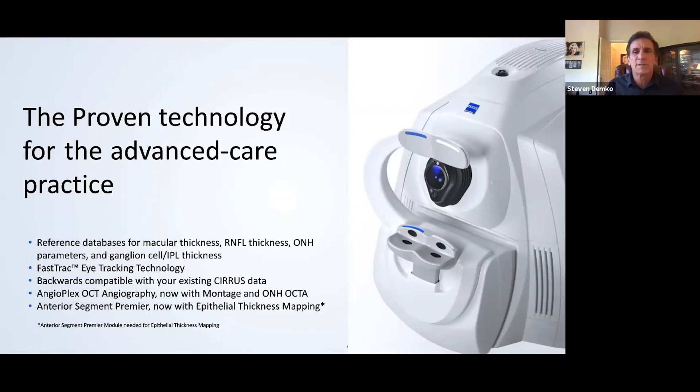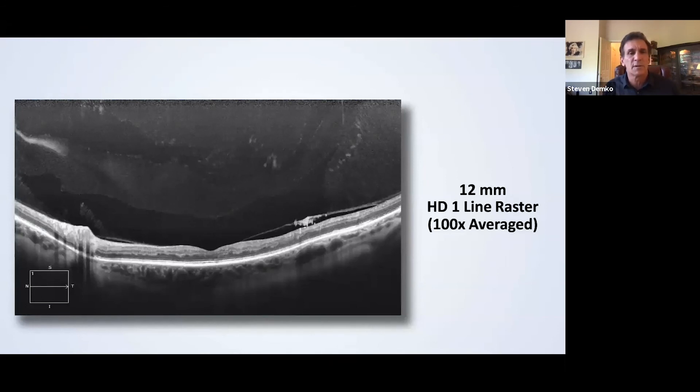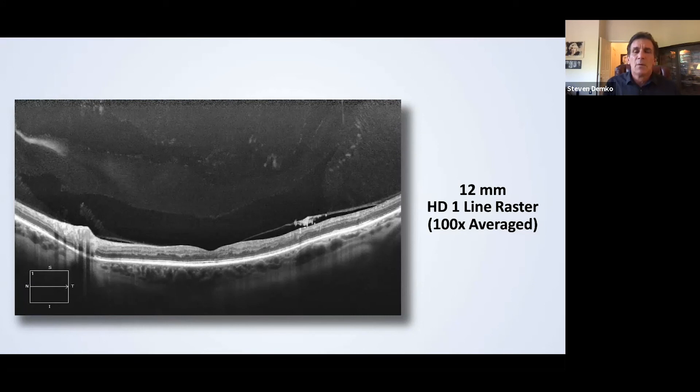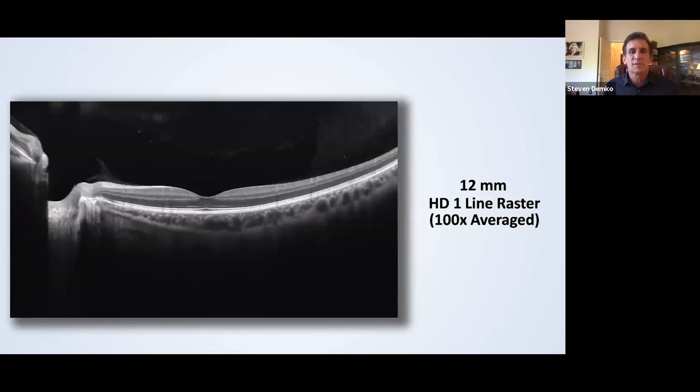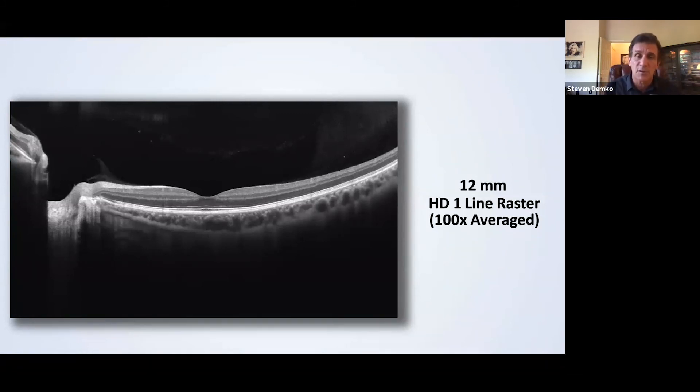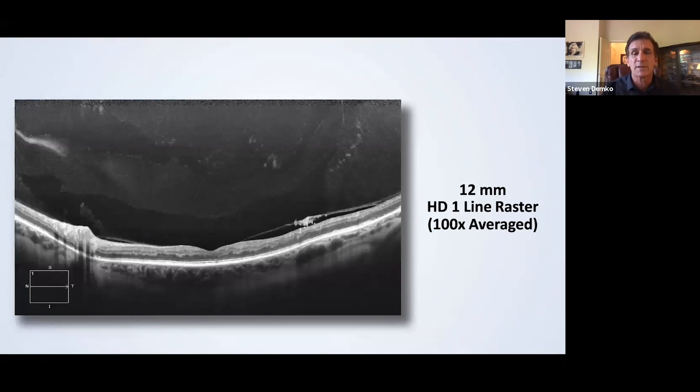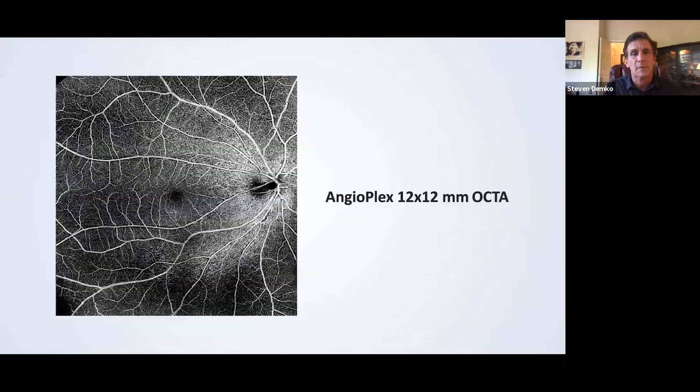One of the nice things about this is the quality of the image. Here you can see the OCT. This is a 12-millimeter OCT. What you really need to do is you really need to start to look at this. This is the normal image. So once you do this on every one of your patients and you start seeing what normal is, when you don't see this, you're going to say, I wonder why that is. And then when you see something like this, you know that that's abnormal.